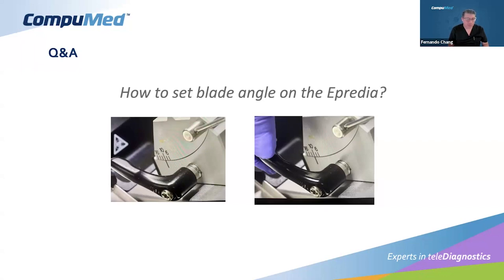Now, how much is the problem? Imagine that we have this sample that has so many lines, and I've seen it before, and so much shatter that it's impossible to read. So the answer is, it can completely ruin the frozen section to the point that it's unreadable. It's completely unreadable. It's not usable for diagnostic.